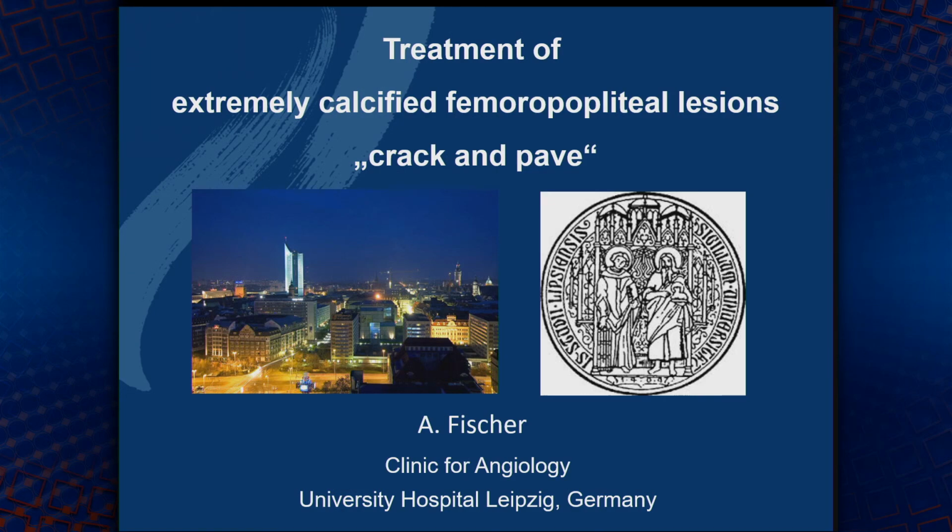I have two short cases showing a certain technique for the treatment of extremely calcified femoral popliteal lesions, which was invented in Leipzig and is frequently done here as well. It's called crack and pave.